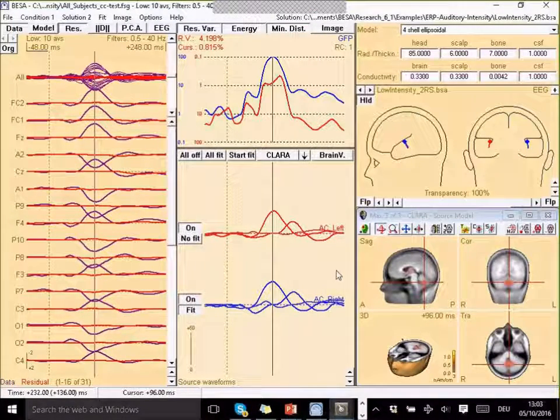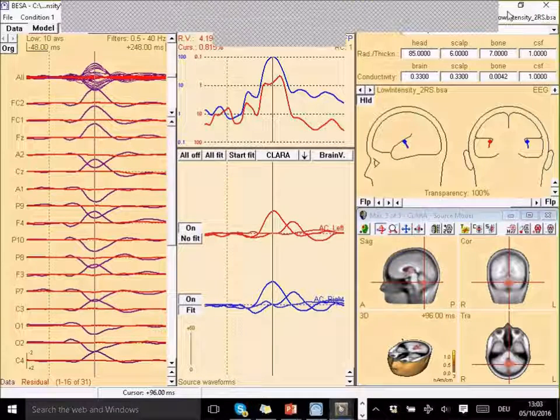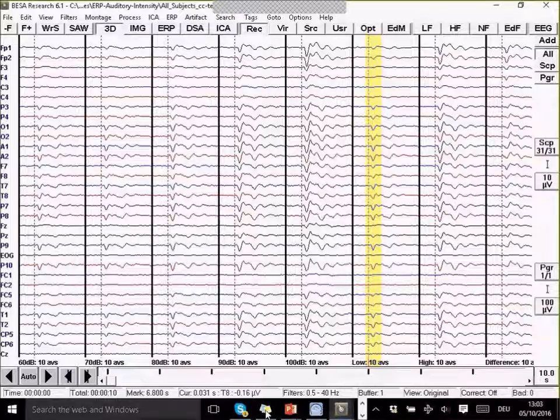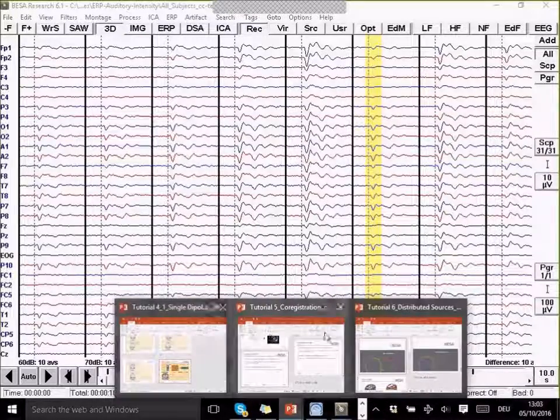Yeah, so since we don't have much time left, in fact hardly any, before the coffee break, I would like to have a very brief talk about our surface-based methods. So let me explain what this is.